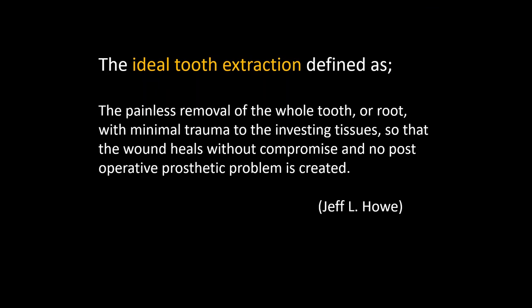So our goal is to take this root tip out as atraumatic as possible. So when I take a tooth out, I want to do it as ideal as possible. And when I looked online to find the definition of an ideal tooth extraction, I found this.